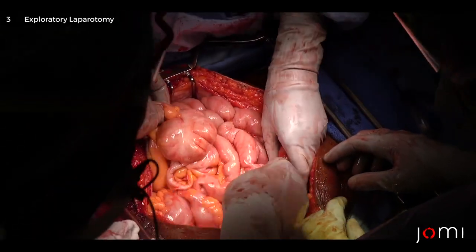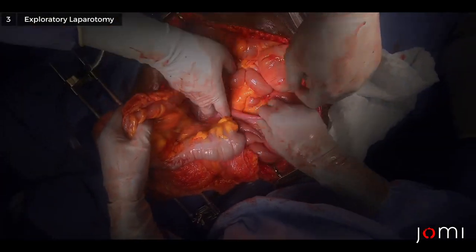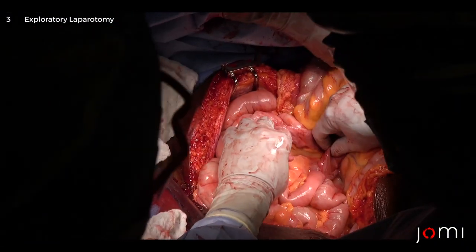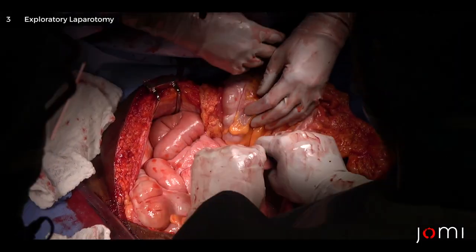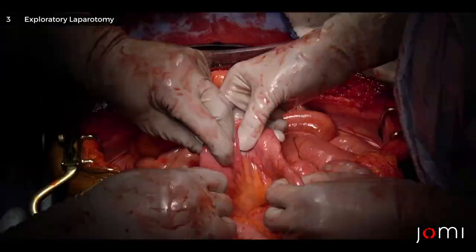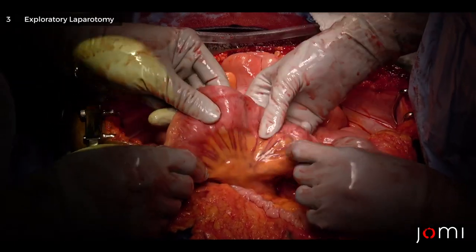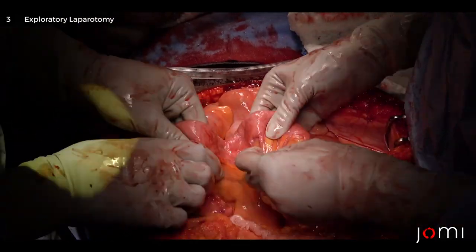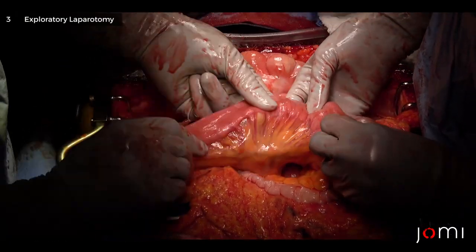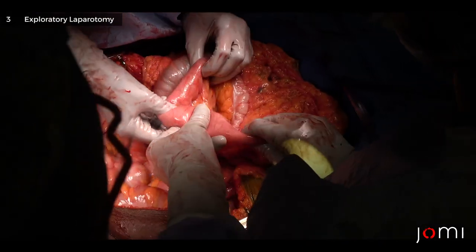We're going to run the bowel real quick, make sure there's nothing we're missing. We'll do this multiple times before we close, but just a quick pass through now. Start at the ligament of Treitz — the suspensory ligament of the duodenum. The transverse colon goes up onto the chest all the way down to the base of the mesocolon. Run the bowel as a two-person procedure, fan out the bowel, milking the lumen along the way and examining both sides of the mesentery, looking for holes, vascular injury, hematomas, contusions — anything not normal.